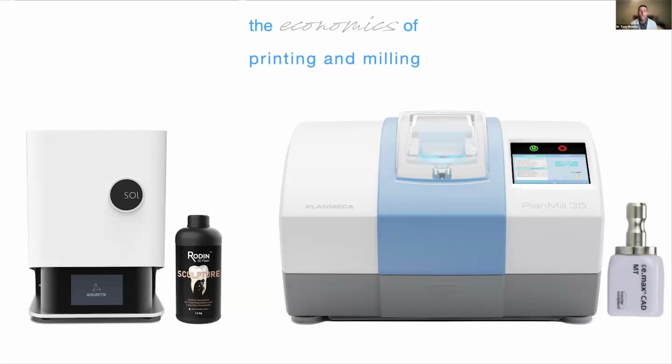So, when you're talking about per restoration costs for a printed restoration, somewhere in the neighborhood maybe of $5 to $10. And for a block of e.max, as you see here, that you would mill in your mill, it's probably going to cost you about $35. So the economics of printing is really attractive because the cost is so much lower.